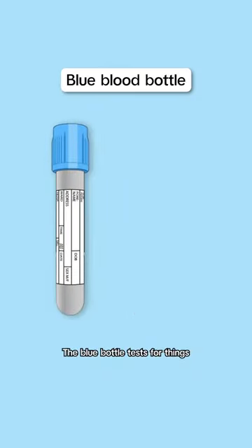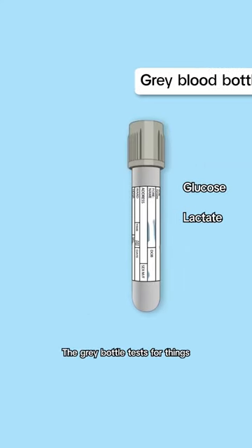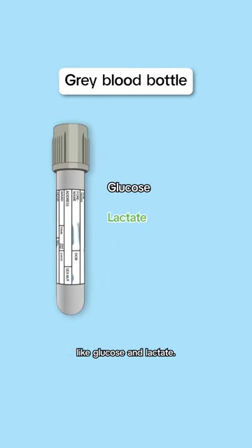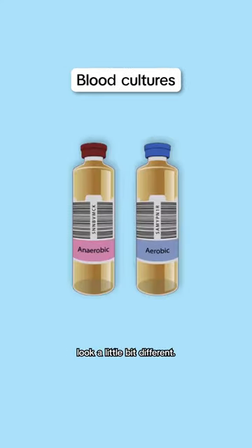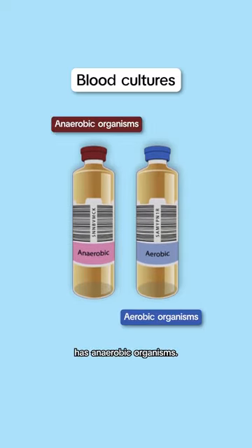The blue bottle tests for things in the clotting system, for example, a coag screen, D-dimer, and INR. The grey bottle tests for things like glucose and lactate. Blood culture bottles look a little bit different. The blue bottle contains aerobic organisms, and the purple bottle has anaerobic organisms.